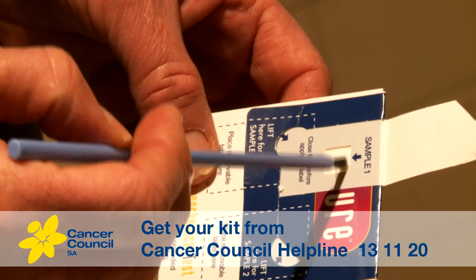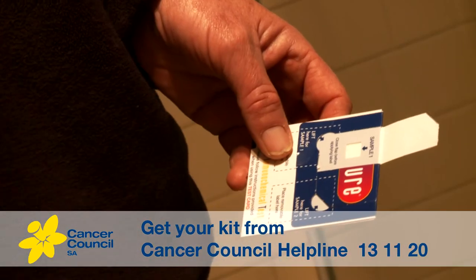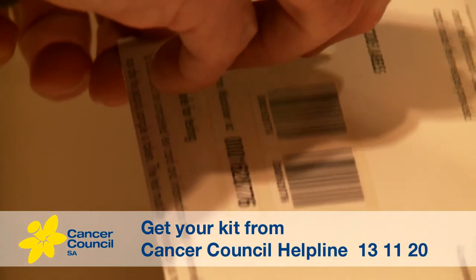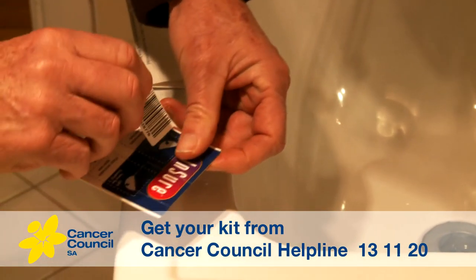Gently dab the brush onto the small white square on the test card. Take the used brush and throw it in the bin. Close the flap back over sample one and stick it down, using one of the barcode labels located on the back of the instruction sheet. First one done — it's that easy.